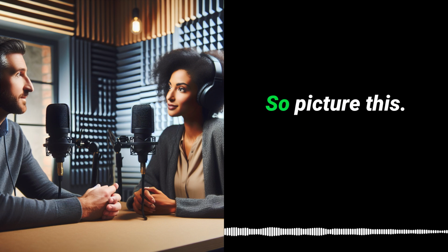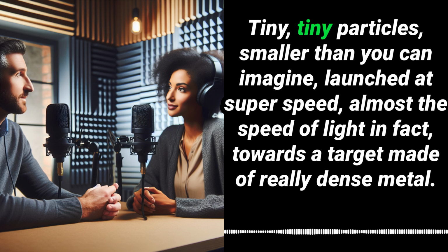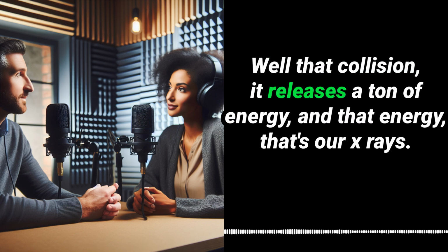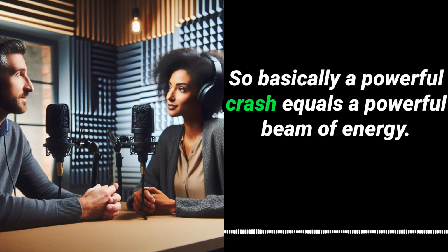Fair enough. So picture this. Tiny, tiny particles, smaller than you can imagine, launched at super speed, almost the speed of light, in fact, towards a target made of really dense metal. Okay, I'm picturing it. What happens next? Well, that collision releases a ton of energy, and that energy, that's our X-rays. So basically, a powerful crash equals a powerful beam of energy.